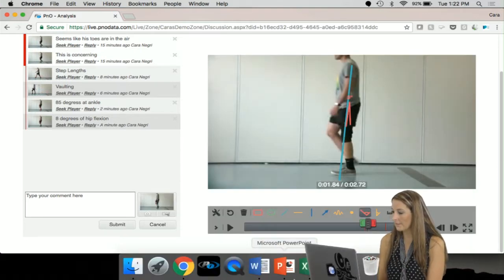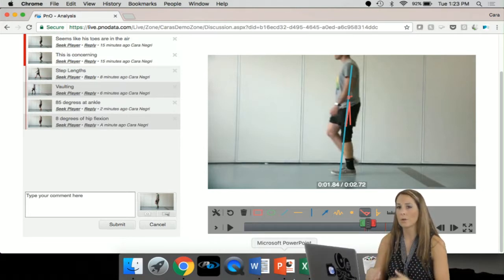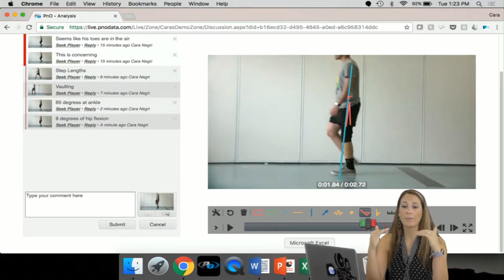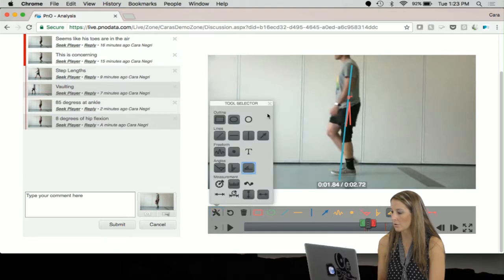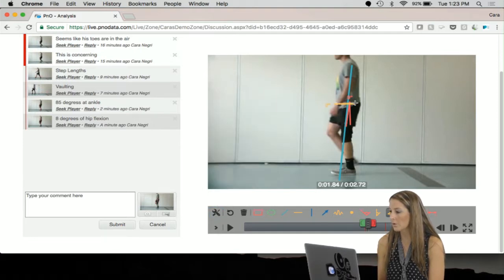Okay, so that's about it for angles. Like I said, sometimes in the coronal plane you may want to use that horizontal angle. If you want to see if the ASIS, both of them, are level, you could put a number with it, but it's not really used in any of the gait scores as a number, but you can use it. So for instance, we'll just show you right here, if we were showing the difference here. So if we wanted to look and see if his hips were equal. Okay, so we'll trash all of those.